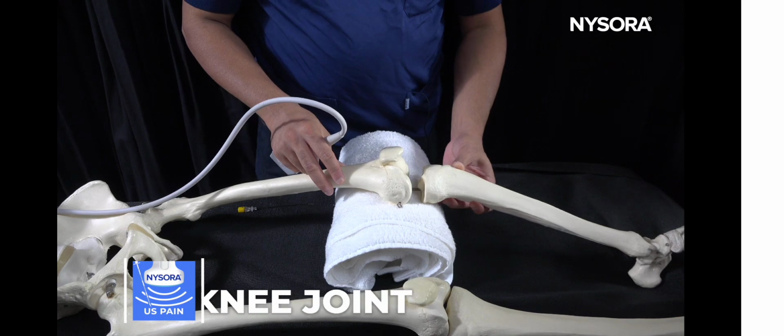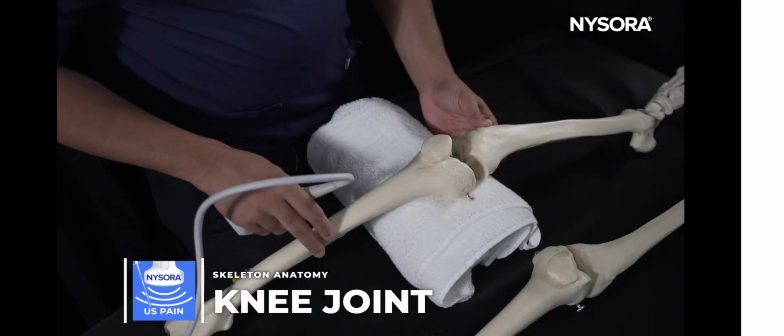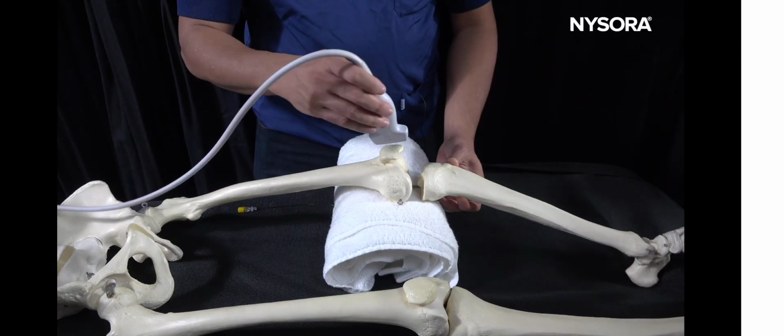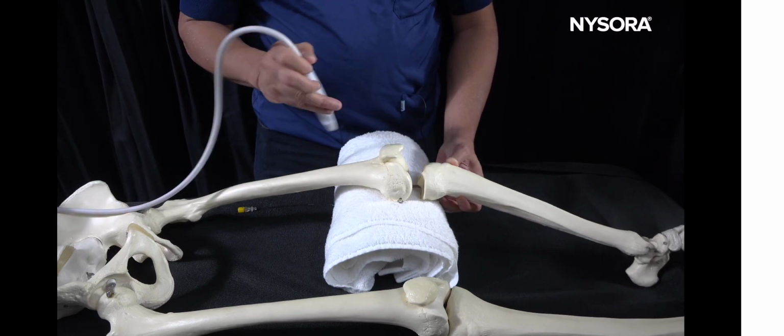I'm going to talk about the skeletal anatomy pertinent to the knee joint injection. There are two ways to scan the suprapatellar recess of the knee joint capsule. You could scan this in a longitudinal way, or you can scan this in a horizontal way.